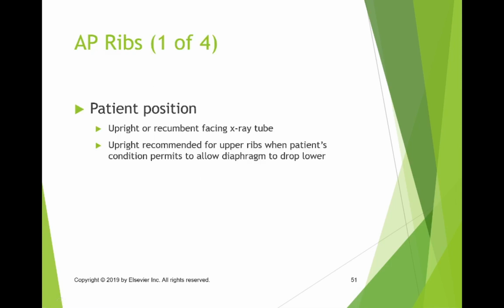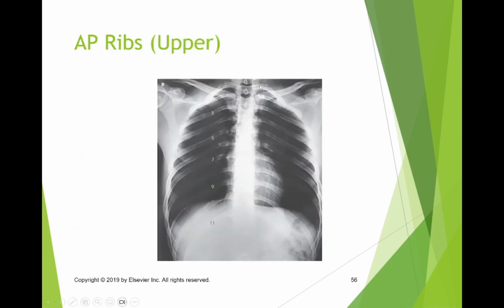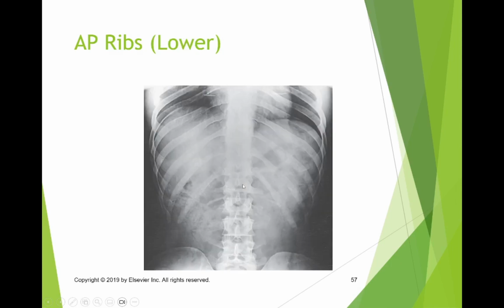So we're going to shoot 2 sets of ribs, one AP above, one AP below. Again, you can count those out if you want to, but on the one for the lower ribs, what we'll want to do is position somewhere around the iliac crest, maybe slightly above the iliac crest. Notice the difference between the inferior portion of the 12th rib and the iliac crest is not all that far. So you're not going to want to go 3 inches above that, because you would run into danger of possibly not including the lower portion of that rib.